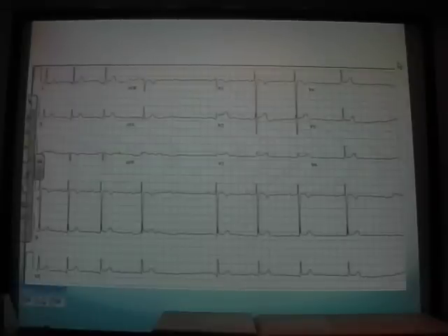And any other abnormalities? Can everyone see that? No, I can't see any P waves. So we've got a P wave right here. And then the PR interval prolongs. I think it might be here. And then we've got a P wave, and we've missed a QRS complex. Then we've got a normal P wave and QRS complex, and it starts to prolong. I think it's about here, it gets even longer still, and then we've dropped a beat again. That's when we're back. Well done.